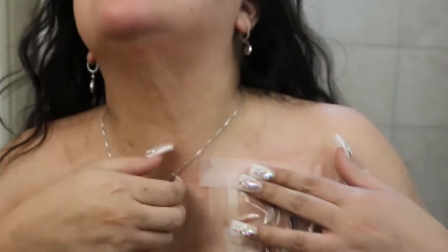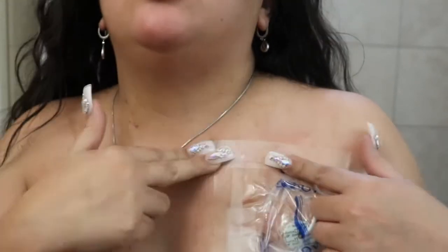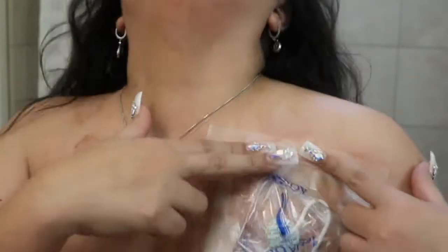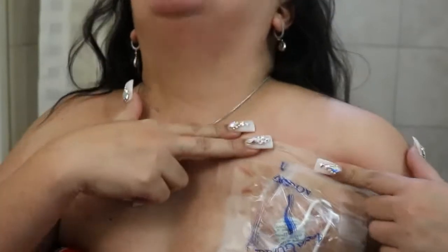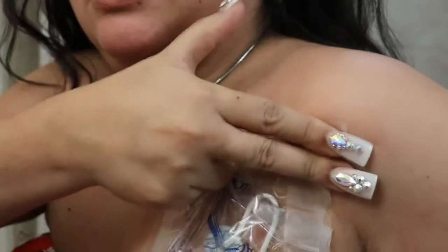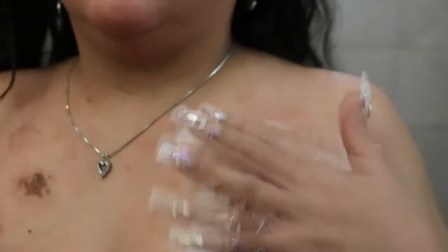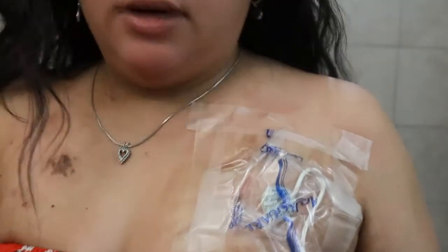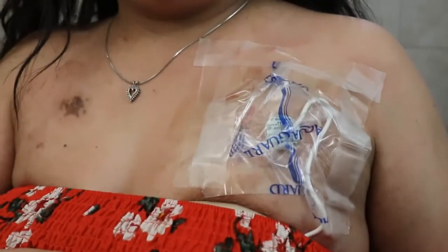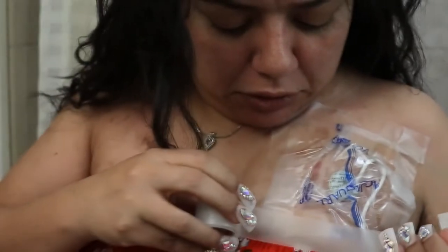Lift up your neck, because you're gonna stretch your head back, and then it's gonna pull it off. When you go back, it'll pull it off. So when you're putting it on, laying it flat, put your head back. Seeing these bubbles? You gotta get the bubble out. And then on the bottom. The bottom that I need is closer to my boob, so that's pretty much all you're gonna get to see.